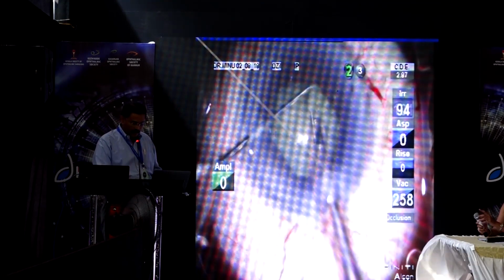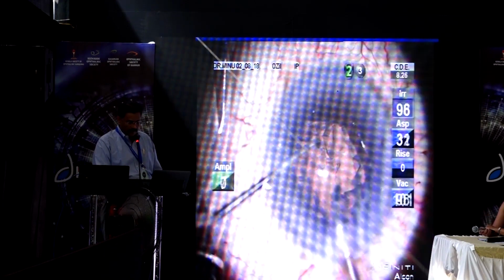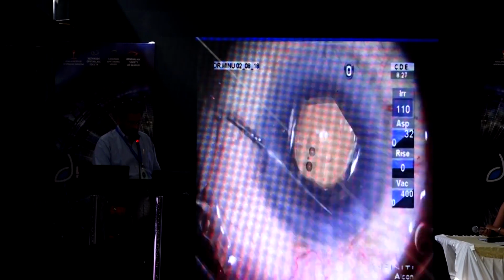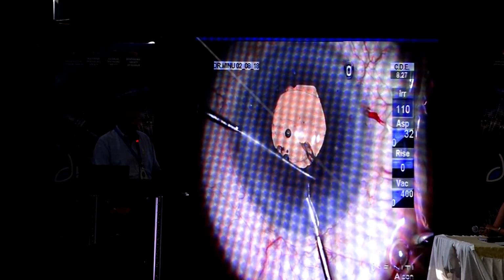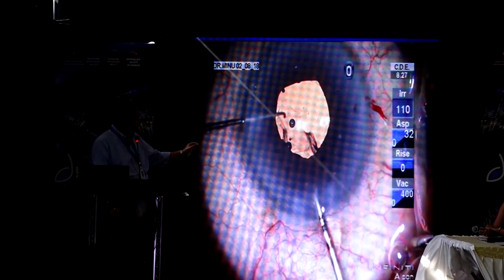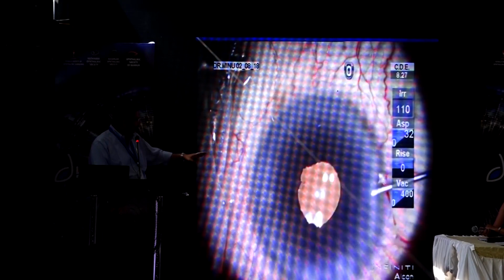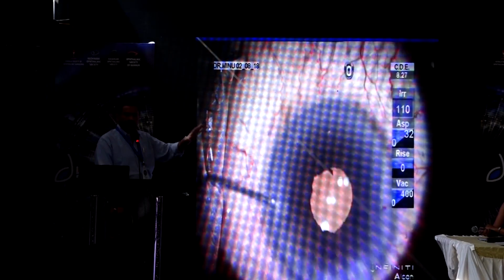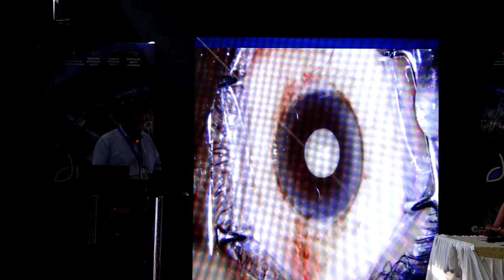And after taking it out, it generally does not damage the sphincter as much as iris hooks if you stretch too much. But this also breaks the sphincter, and there will be some irregularity. One can be taken out, and the rest will follow. It can come through the paracentesis and easily comes out. So not very bad, and it doesn't tear that badly, just because it is not stretched too much like your iris hooks.